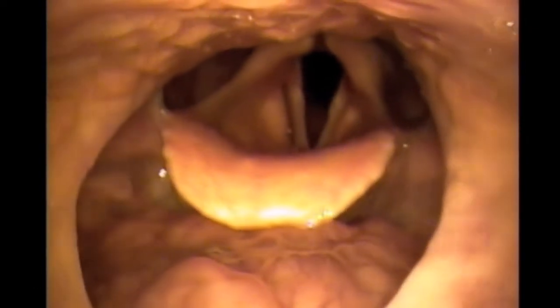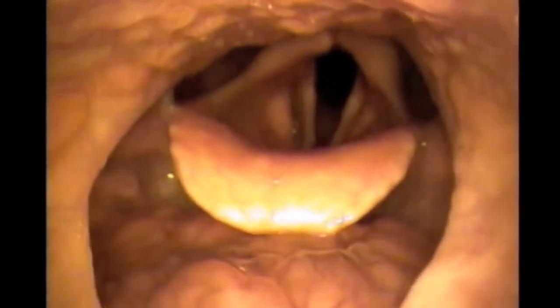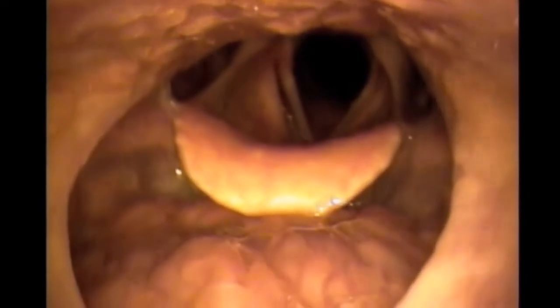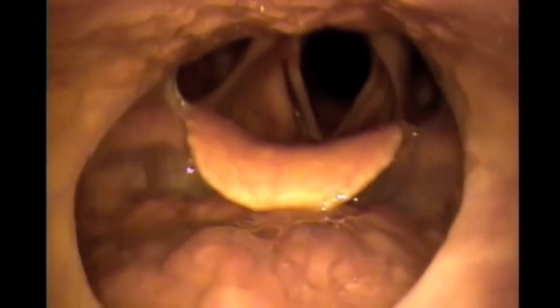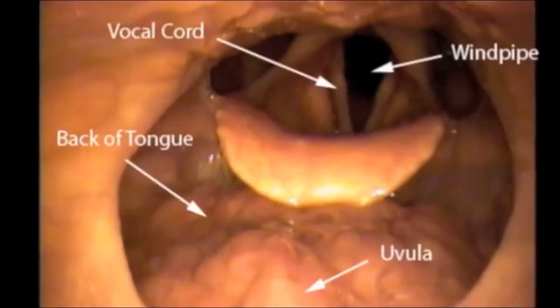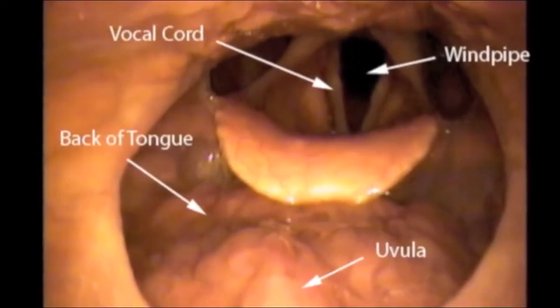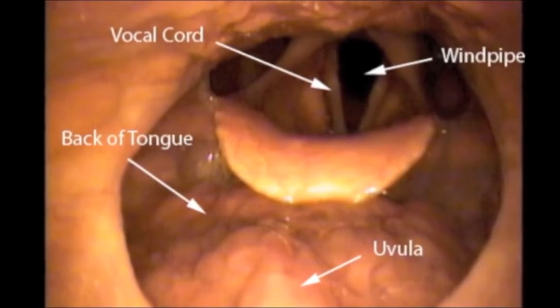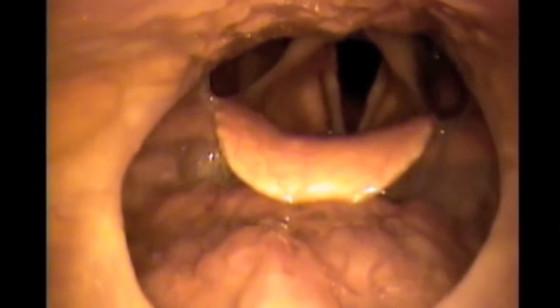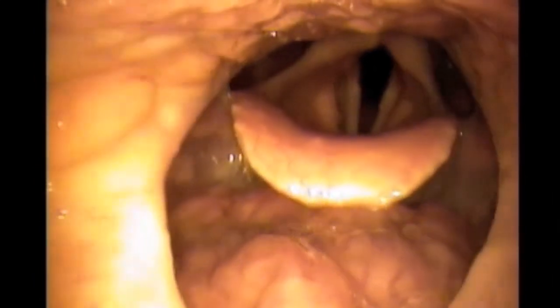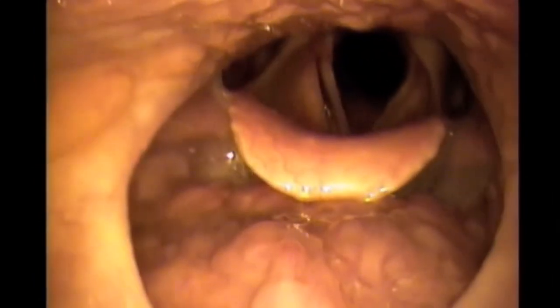Shown here is what the upper airway looks like in a normal sleeping individual who is not snoring. The airway is completely open without any areas of obstruction or vibration.